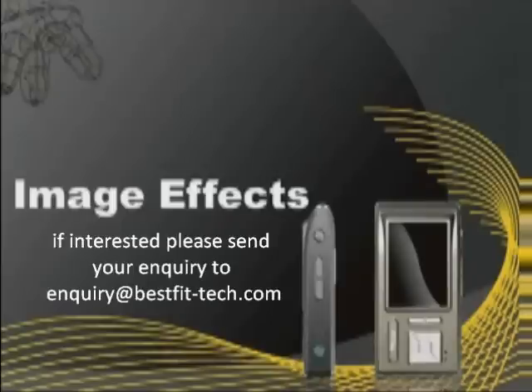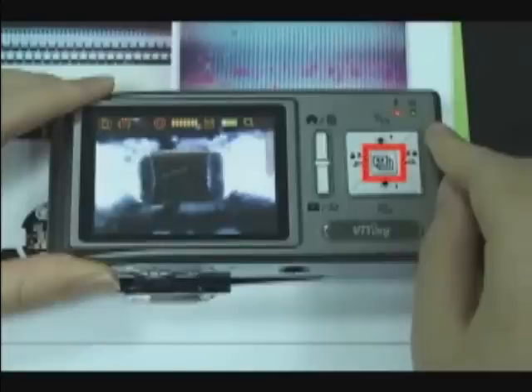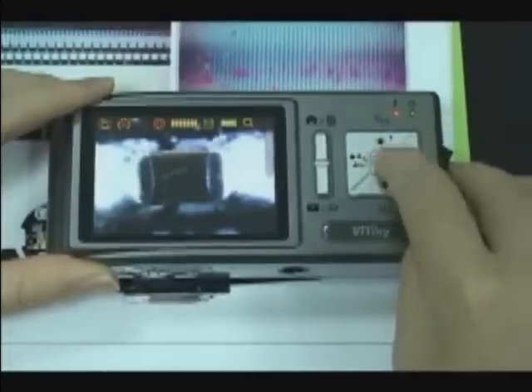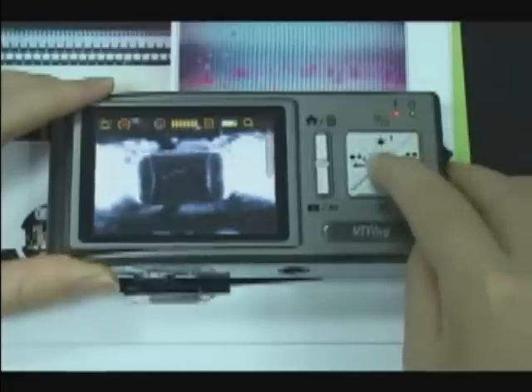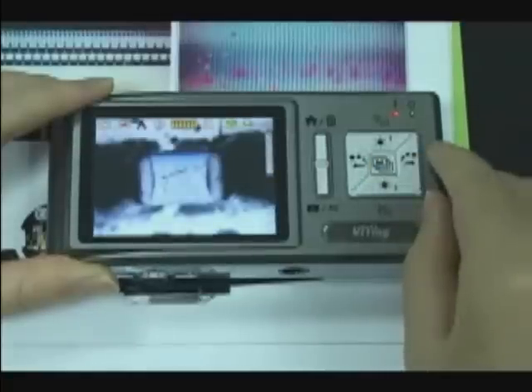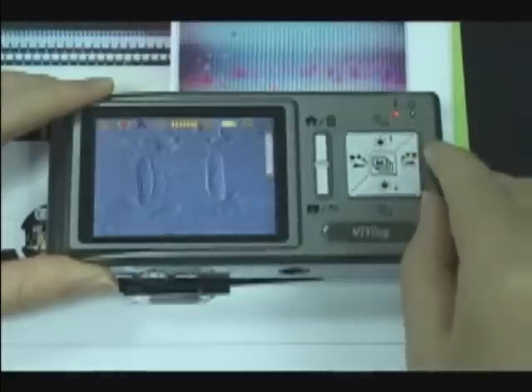Image effects. Press the middle button to switch image effects, which are: normal, grey, inverse, and color inverse.